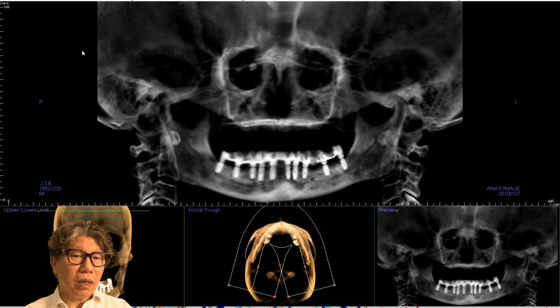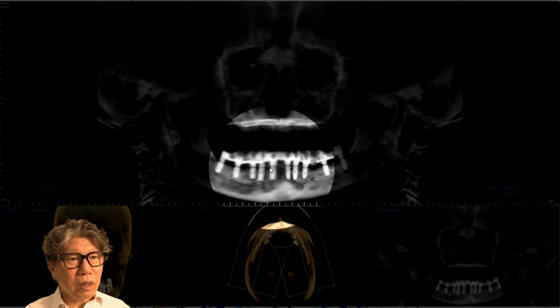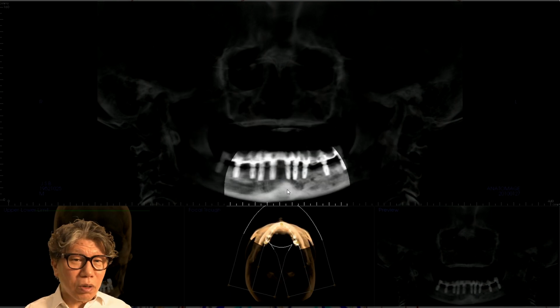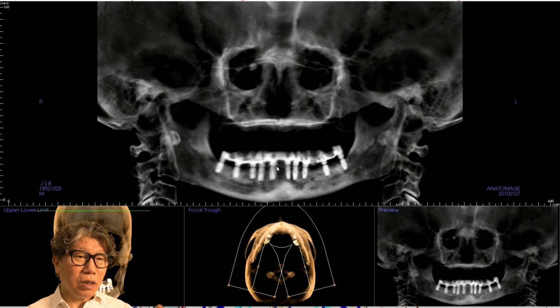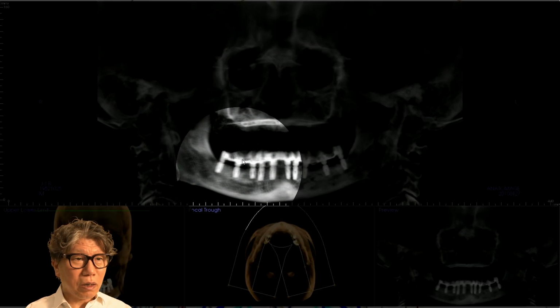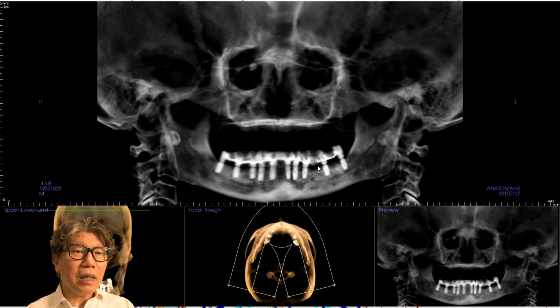I use this a lot to replicate prosthetics. So this is done by titanium casting. It's about the multi-unit abutment, all on X to all on 10. These days, there is also all on 6. There is also all on 8. In the Brånemark implant, all on 6 was initially developed. However, I felt uneasy because the back was broken. The frame of this prosthesis kept breaking. Therefore, it is now recommended to perform all on X if possible.